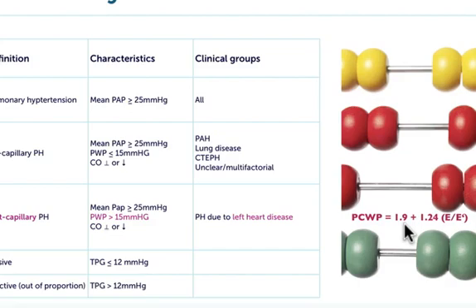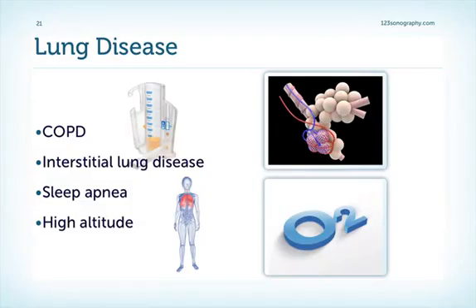While other methods, newer techniques like strain or strain rate, are supposed to help you and give you an estimate as well.